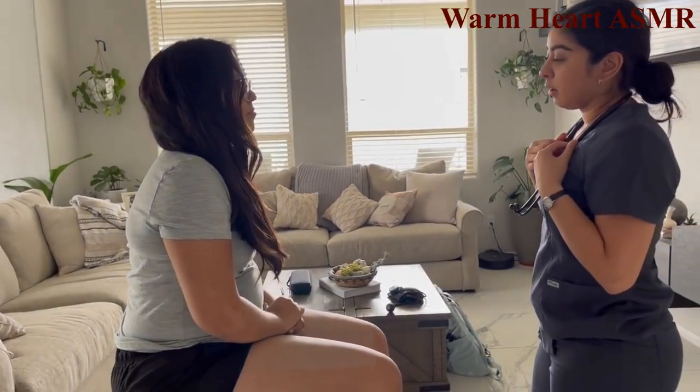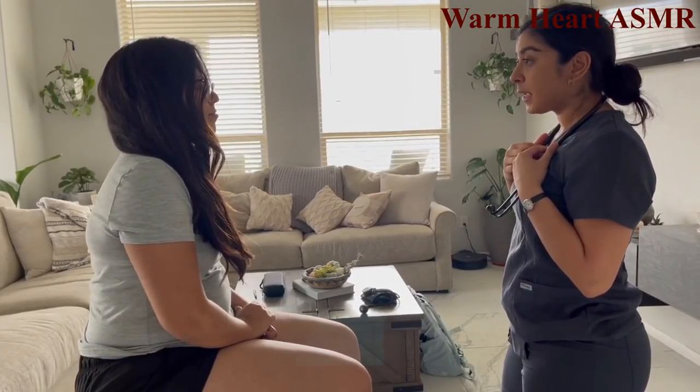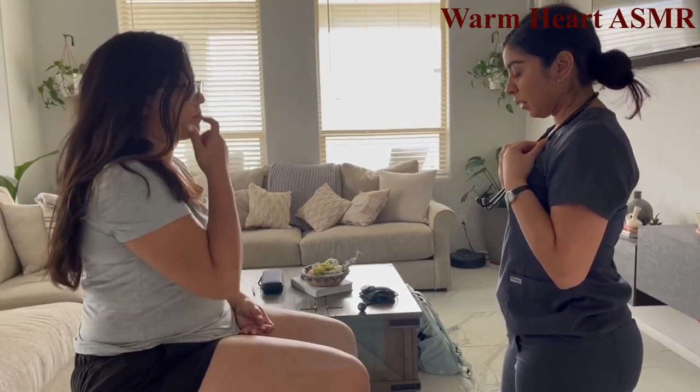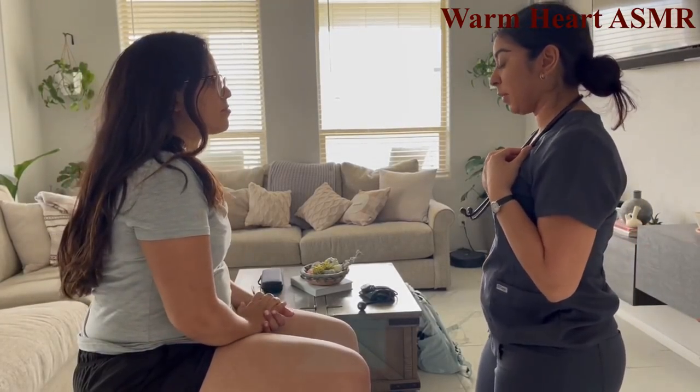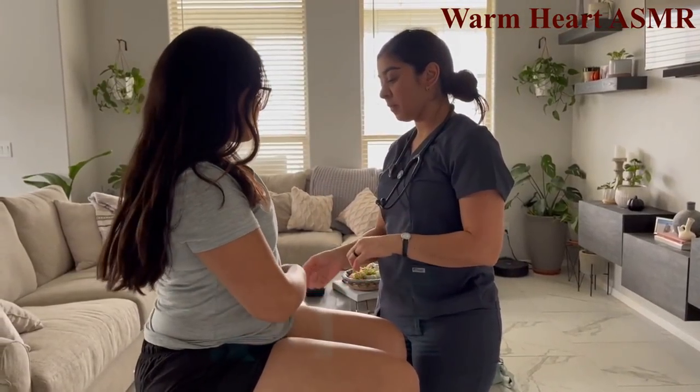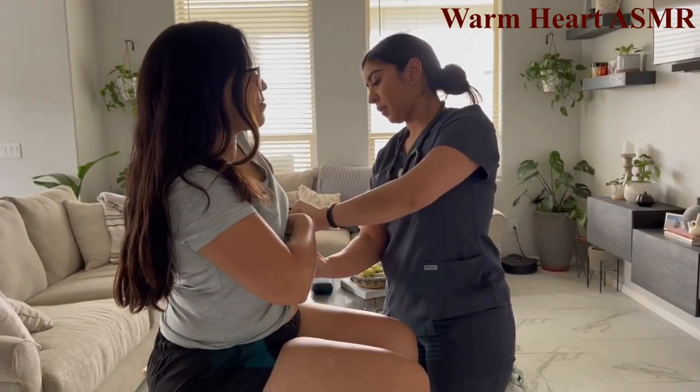Have you noticed any chest pain or palpitations? No palpitations. Now palpating the apical pulse — just lift your arm and your shirt for me.